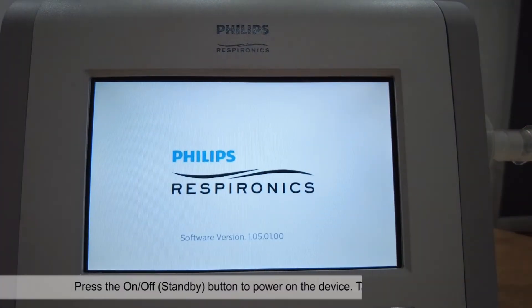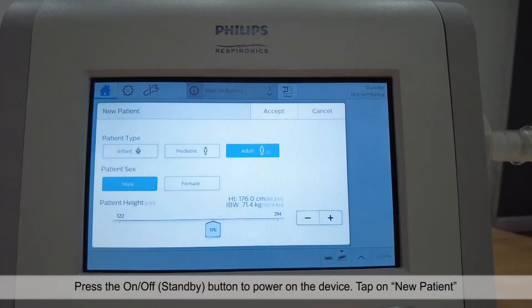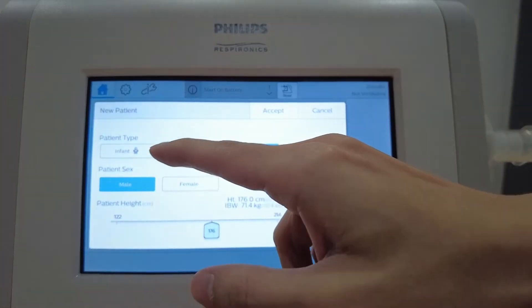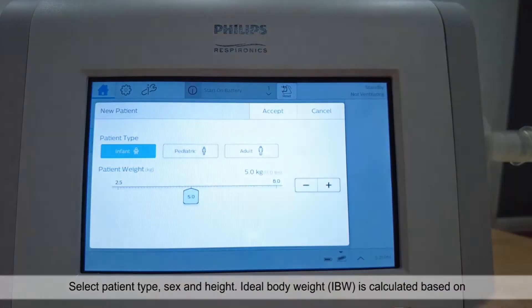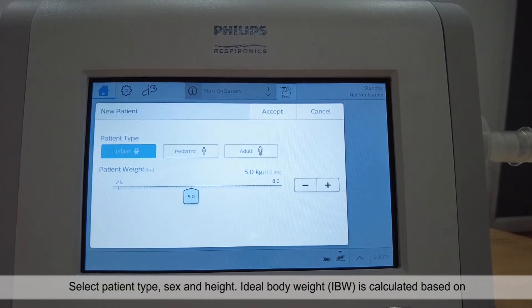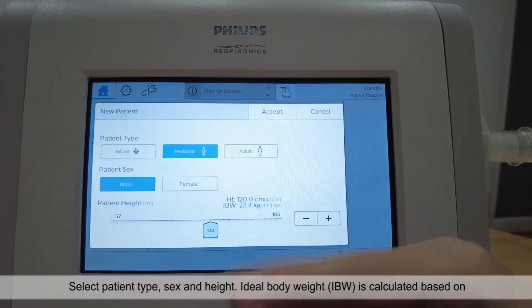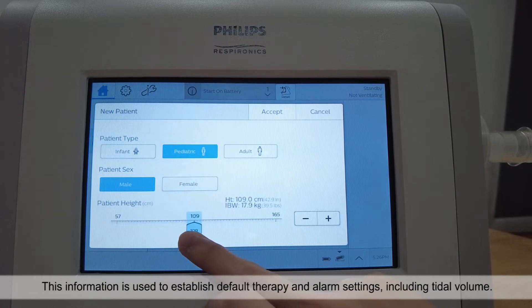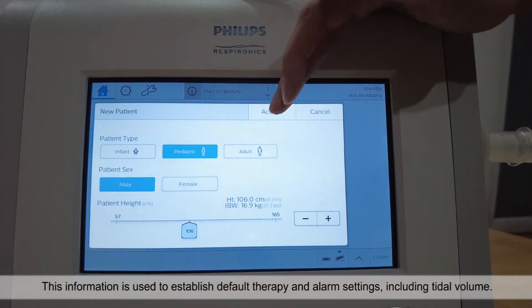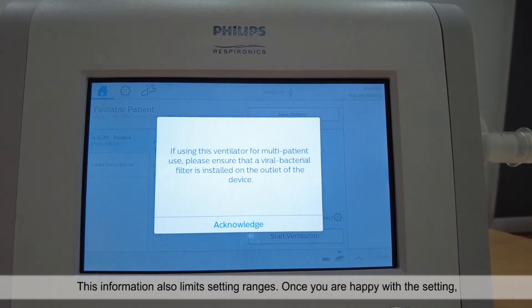Press the on-off button to power on the device. Tap on new patient and select patient type, sex and height. Ideal body weight is calculated based on height and gender. This information is used to establish default therapy and alarm settings, including tidal volume, and also limits setting ranges.